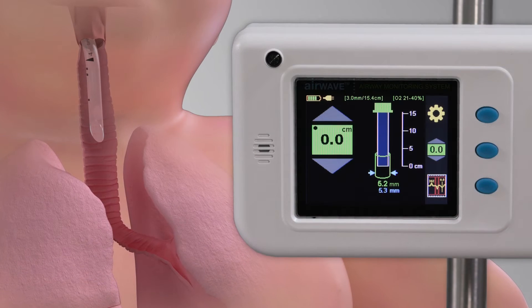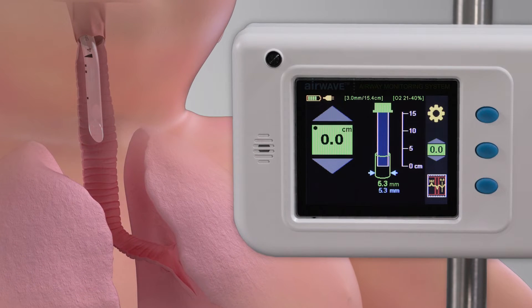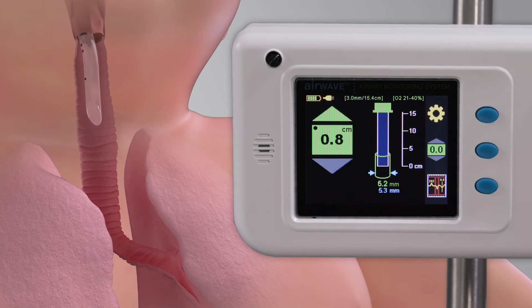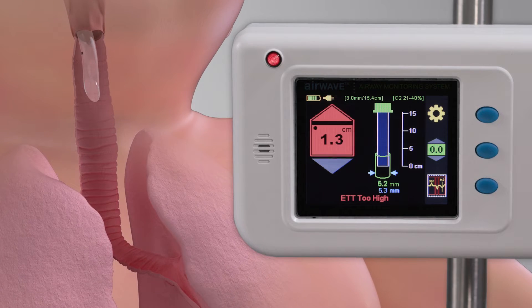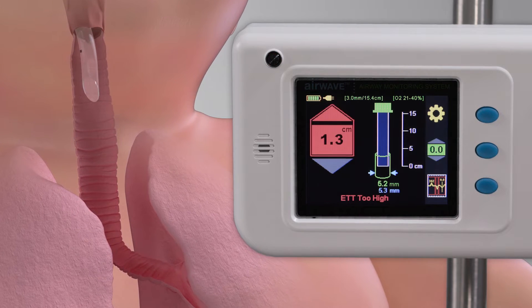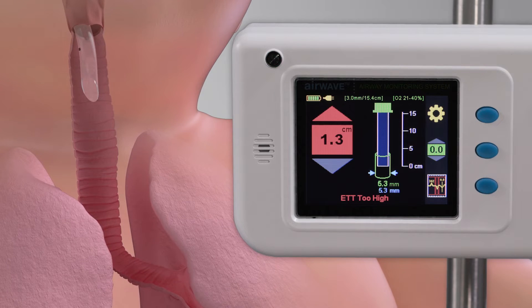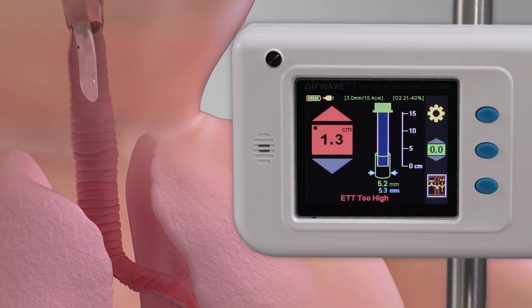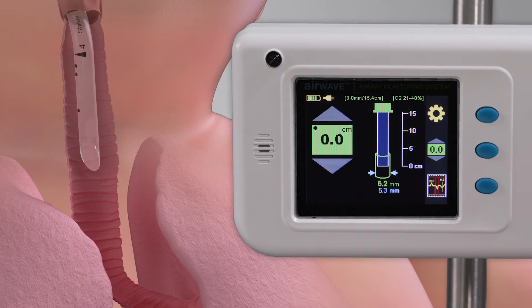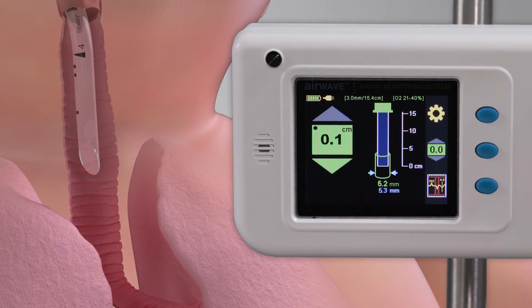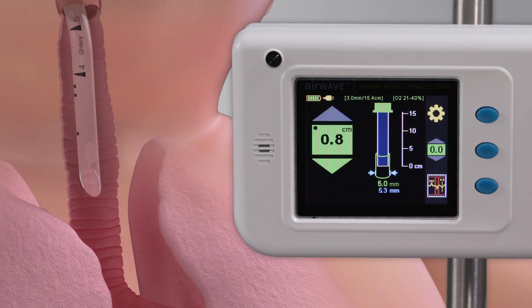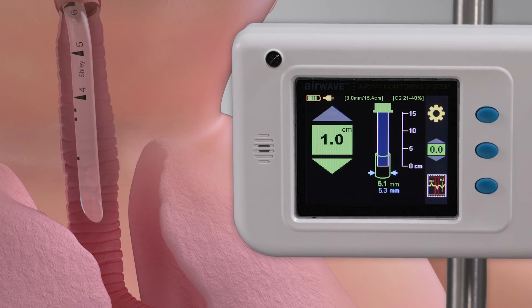The first continuous measure is movement and direction of the ETT tip. You will see upward movement from the set baseline location and an indication if the tube is too high. You will also see downward movement from the set baseline location with an indication if the tube is too low.